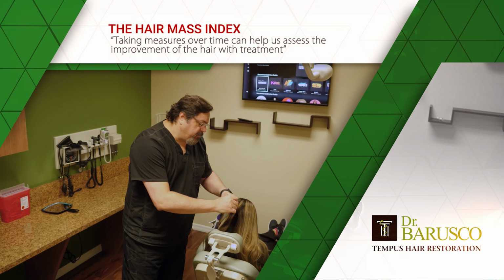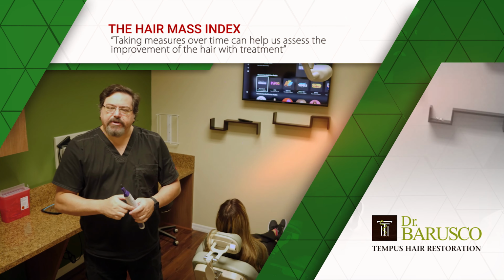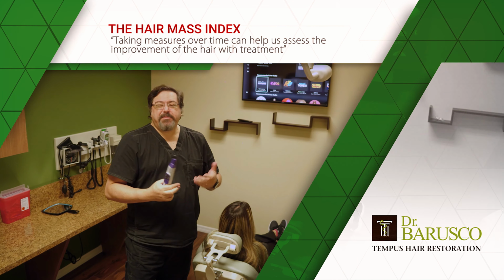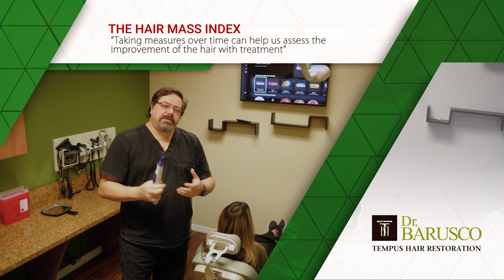So from 130 to 140, you can see that there's a little bit of a difference. There is a little margin of error with this. So I would say it's pretty mild. It's pretty minimal hair loss. If anything, she doesn't have a lot of thinning going on. It's just a little bit of shedding.